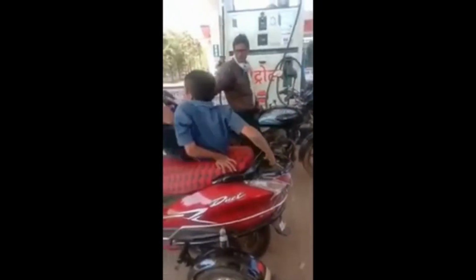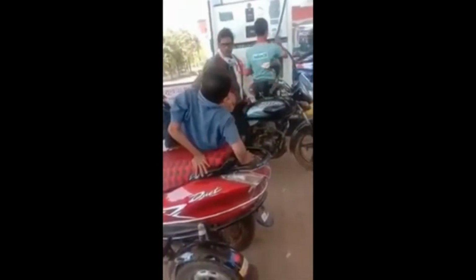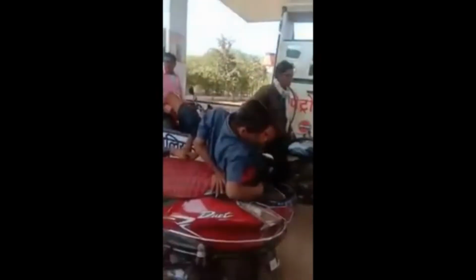Lastly, now I am attaching a video. I was stunned while seeing this video on YouTube a few years back. You can see the entire video again and again. I am giving a question. Now tell me, what is the type of this conjoined twins? Please give your answer in the comment section without fail.